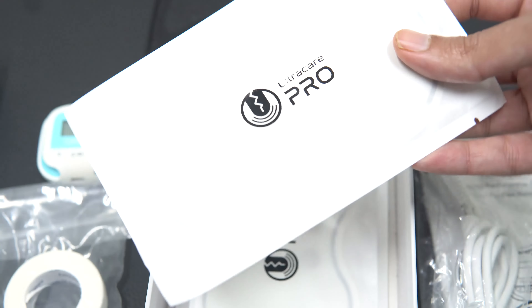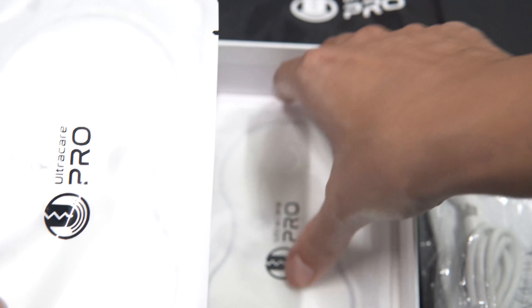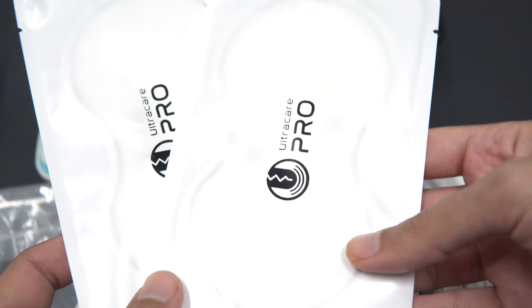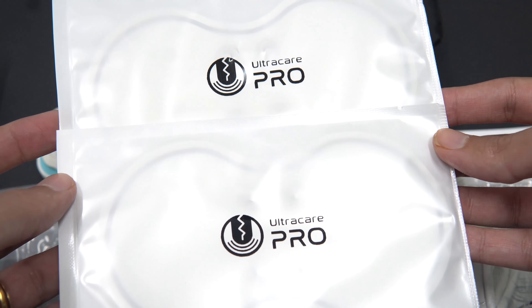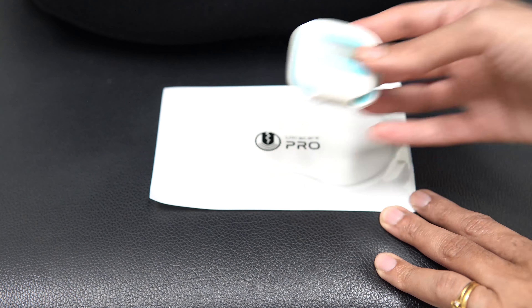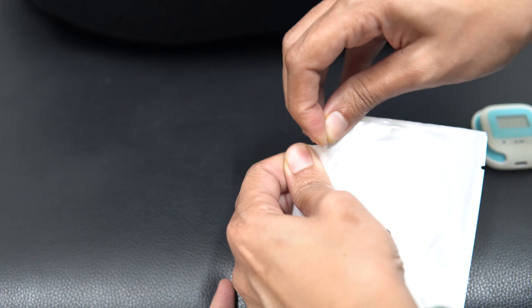You get two electrode pads which have to be attached to the TENS device. Now let's quickly move on and see how to use this product. First, let's take one electrode pad out of the two that you have got.